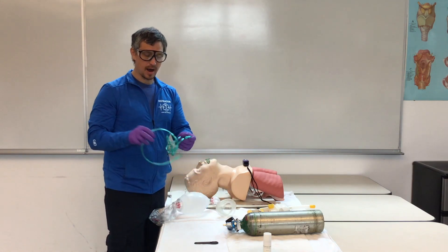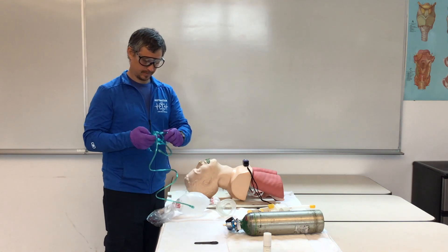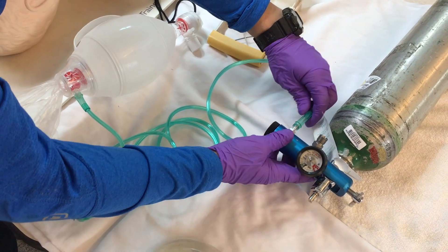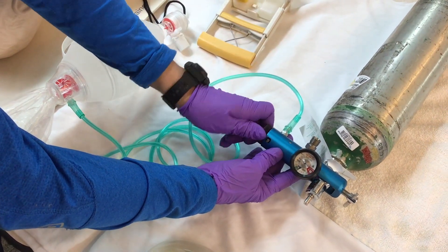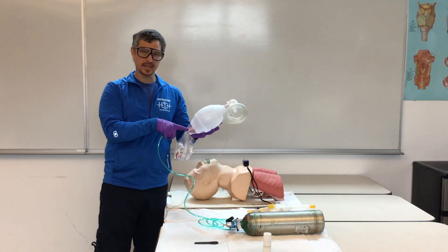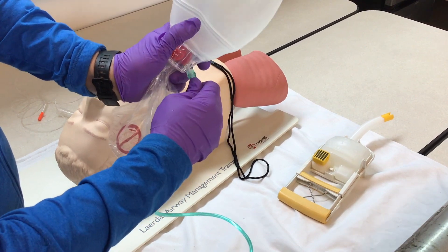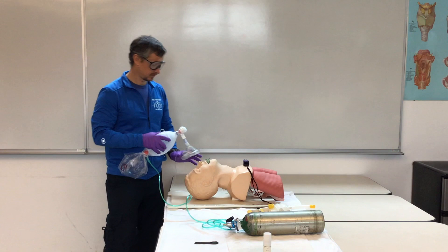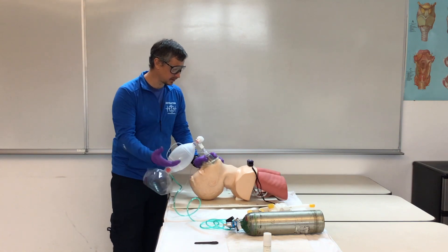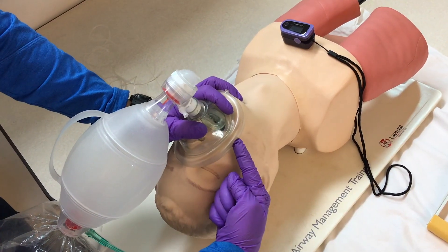Then we're going to grab our oxygen supply tubing, which connects to our regulator as learned in our oxygen administration station. We're going to turn this to 15 liters per minute. On the backside of our BVM, the male and female pieces attach, which starts to fill the reservoir bag. Then again, make sure you have a good seal on your patient's face — head tilt, chin lift, your C and E grip, pulling the patient's face into the mask and squeeze.